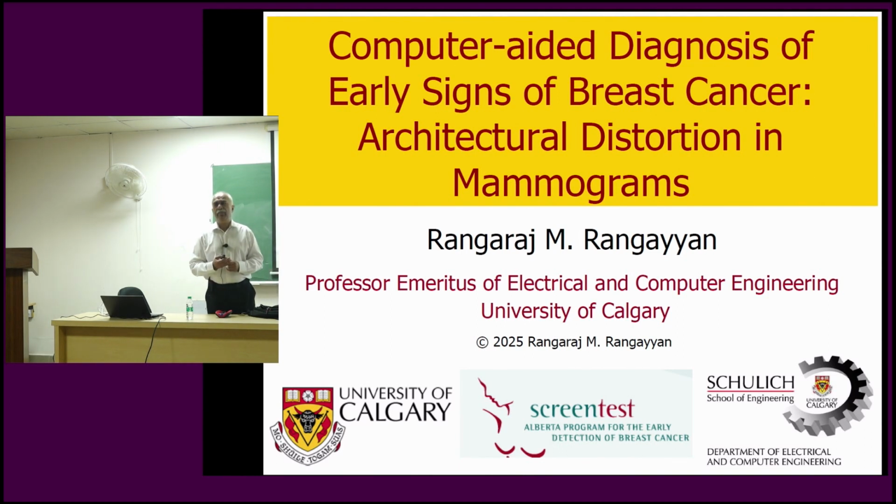Commercial CAD systems have been around for about 20 years, licensed by the United States FDA. And they are used, but they are used as what is called second opinion. The radiologist has to first interpret the mammograms, record the interpretation, and then look at the output of the CAD system, and then may or may not change the initial diagnosis. It is like if a radiologist has some difficulty or doubt about the current case, the radiologist goes and talks to another radiologist. The same thing, now it's a computer.